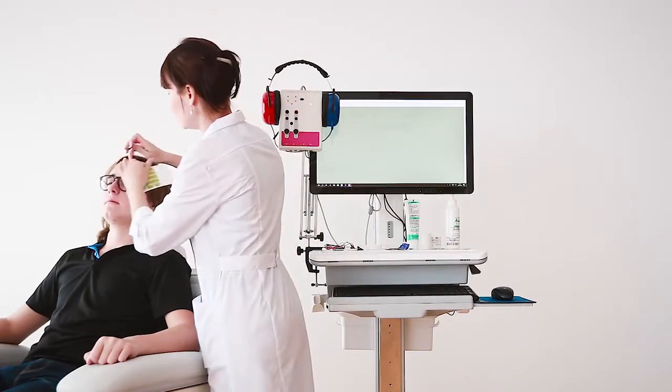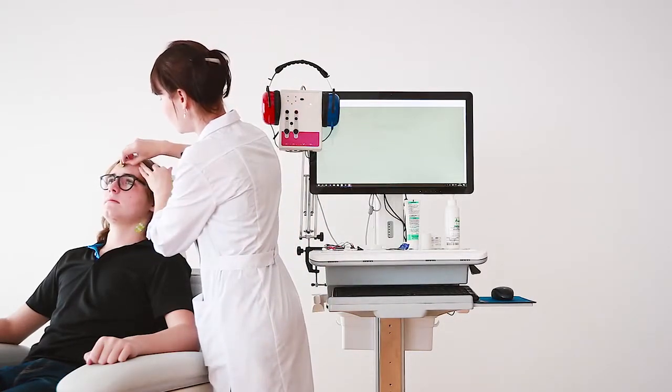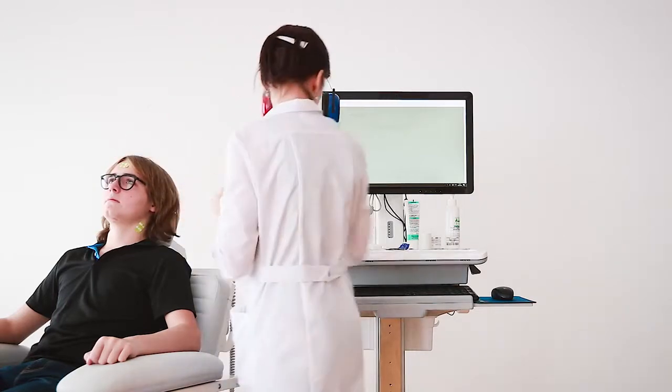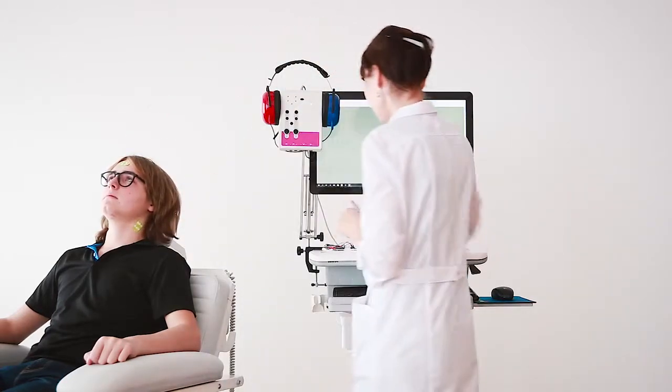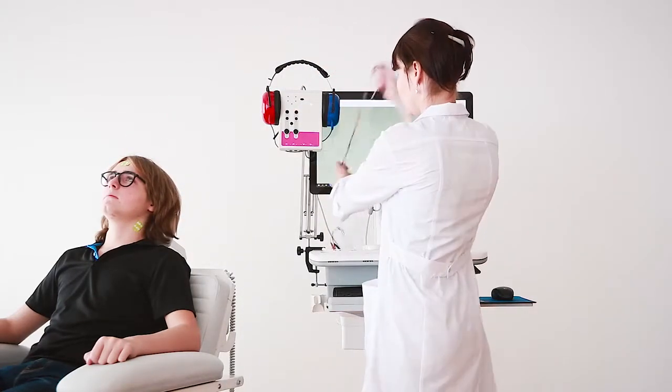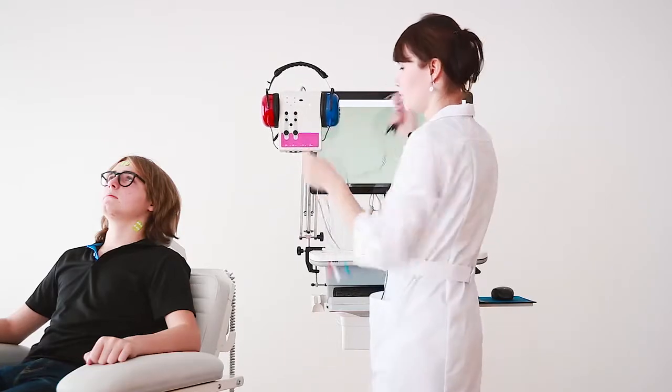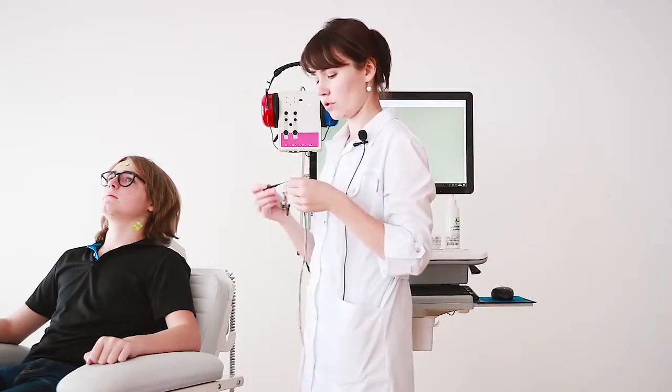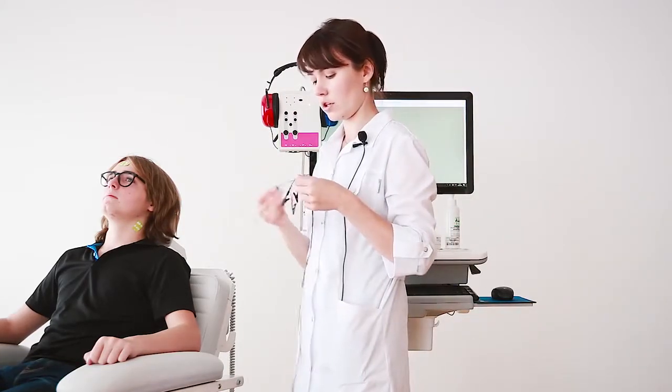The reference electrode we will put on the clavicular and the ground on the forehead. Now we're ready to connect the electrodes to our amplifier using alligator connectors.